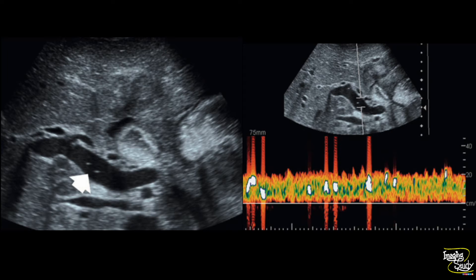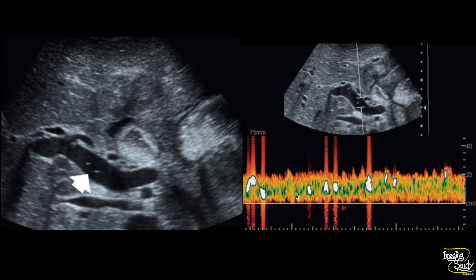Here is another case of portal venous gas. An oblique view through the liver hilum shows two small bright reflectors within the lumen of the portal vein. On real-time imaging, multiple similar reflectors were seen flowing throughout the portal venous system. On pulse Doppler with a reverse rainbow color map, multiple bright white signals are embedded within the portal vein signal, representing strong reflections from the gas bubbles, with artifactual signal spikes associated with many of these bubbles.